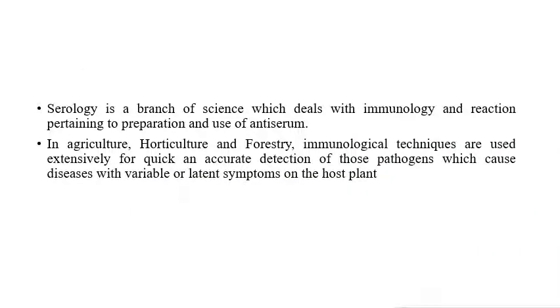So here, serology is a branch of science that deals with immunology, or antigen-antibody reactions. Due to these antigen-antibody reactions, we can easily identify the particles of plant viruses, or the presence of plant viruses, in the given sample. This technique can be widely used in agriculture, horticulture and forestry, and immunology techniques are extensively used for the detection of different types of plant pathogens, especially plant viruses.